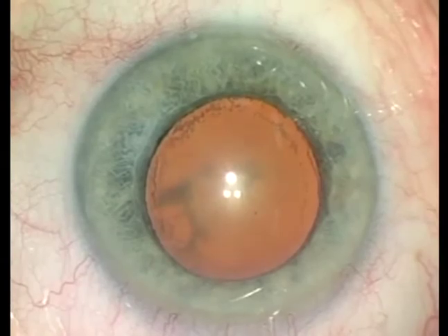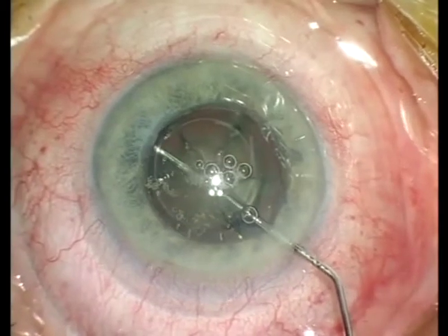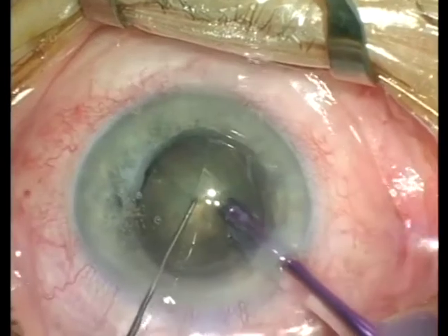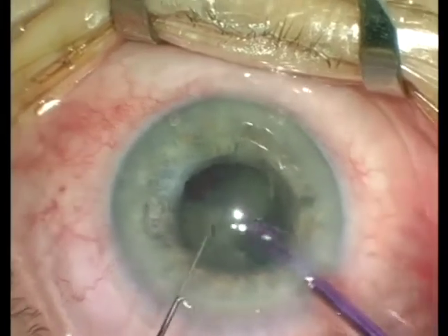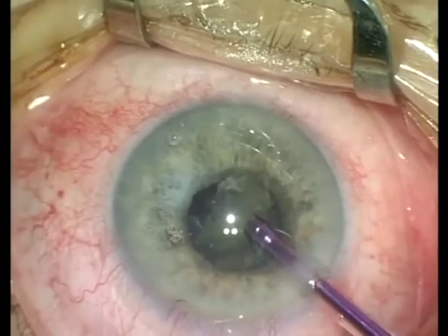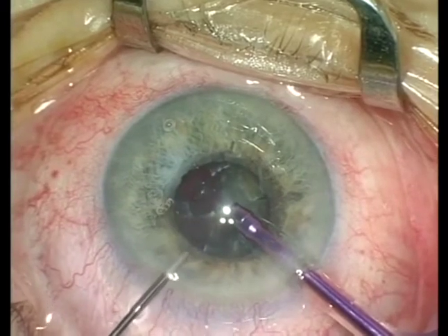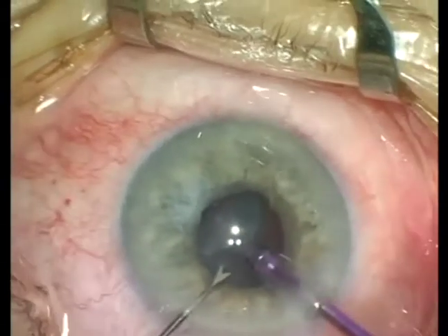At the beginning of the surgery, we have a pupil of about 5.5 mm, and after creating capsulotomy and releasing the gas from the capsular bag and performing hydrodissection, phacoemulsification is now being done following the cracks performed by the laser energy. During the procedure, we can see that the pupil starts to constrict, which is not an infrequent case in patients with intraoperative floppy iris syndrome. The attempt to stabilize the iris tissue and expand the pupil was done with the help of viscoelastic, however, with limited effect.